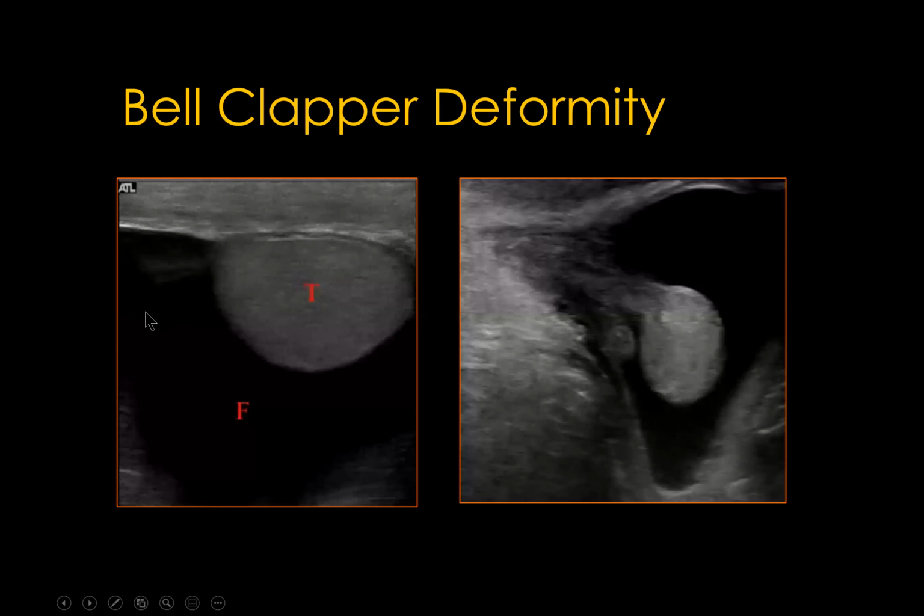Look at this image: there is hydrocele within the tunica vaginalis. There is no fluid in the posterior testis because of the absence of tunica vaginalis in this area. And what about this image? In this case, the testis is completely surrounded by hydrocele, hanging on the extremity of the spermatic cord, and this patient is at high risk for spermatic cord torsion.